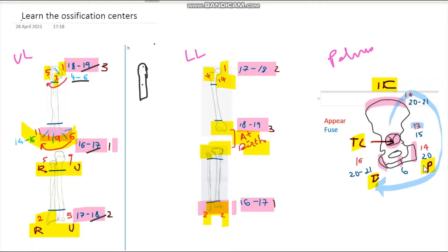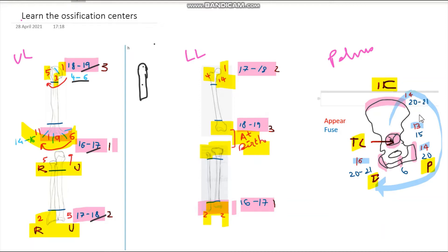The iliac crest appears at 14 years of age, the pubis also appears at 14 years of age — so there are two 14s — and finally the ischium appears at 16 years of age. So: tri-radiate cartilage at 13, crest at 14, pubis at 14, ischium at 16. Now when do they fuse? They fuse at 20 to 21 years of age.